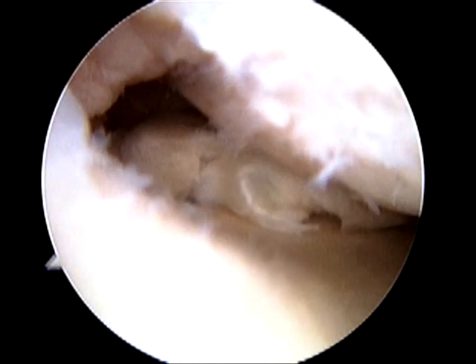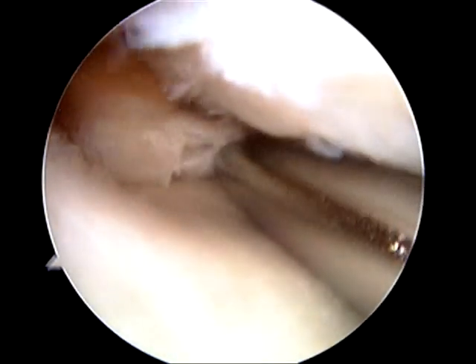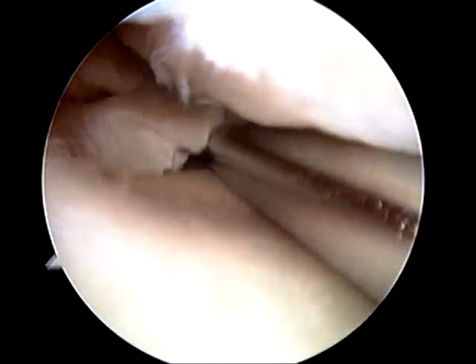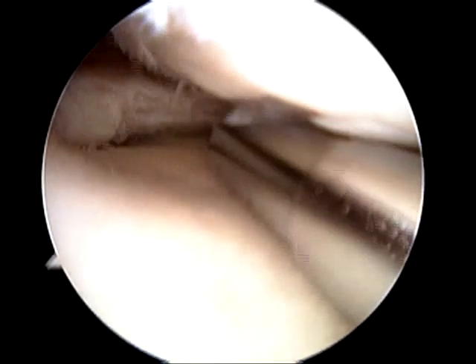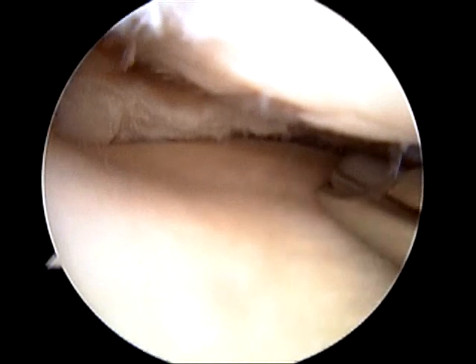The shaver will now be used to remove the fragment from its attachment because the shaver is able to suck and cut at the same time. It is also used to remove any other debris floating around the knee that has been left from the procedure. You can see here that there is a small little piece of a torn cartilage left floating in the back that is easily removed by the shaver, and a small rough edge on the femoral condyle that is smoothed as well.